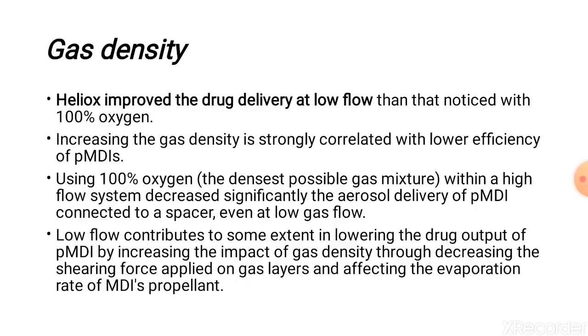The gas density: like the ventilated patient, the lighter gas is much better than the heavier oxygen gas. So when you deliver aerosol, try to use a lighter gas like helium or something like that.